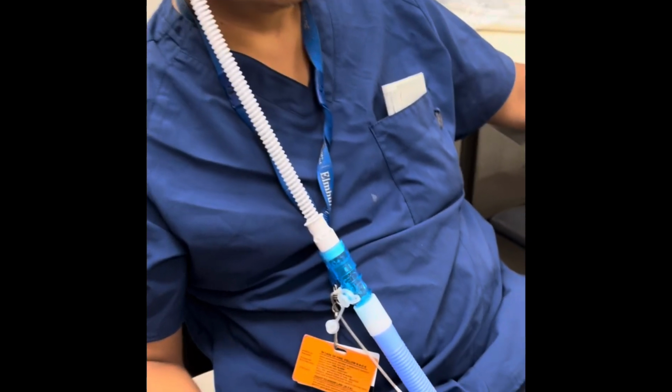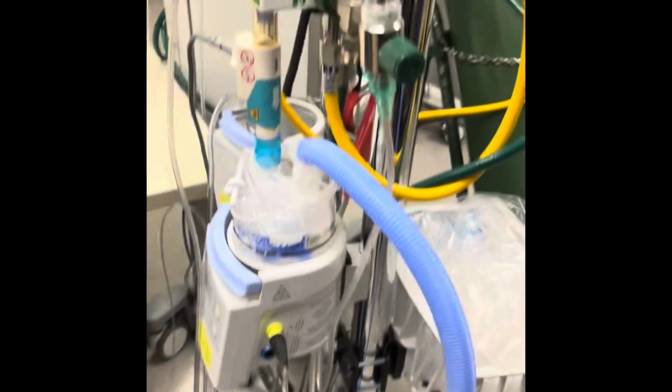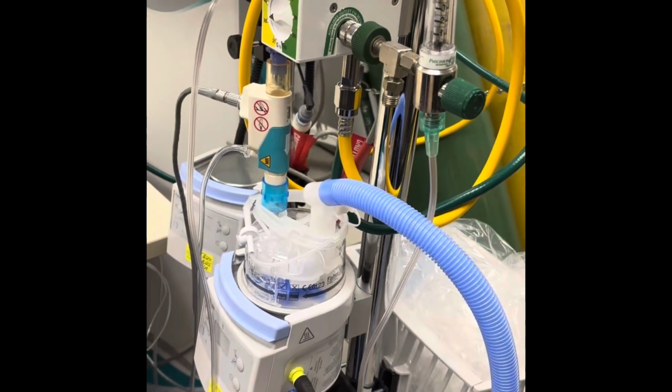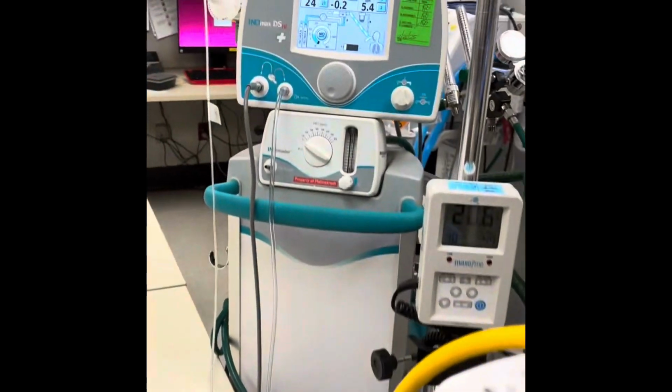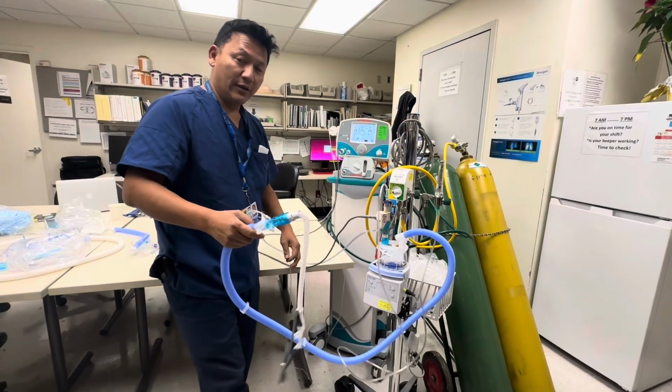But you need the blender though. But it's set at 2 right now. Yeah. If you don't set it at all, what happens? No, wait. You're gonna need something, right? You're gonna need that flow. You need the flow to deliver the medication, DJ. Yeah. You can't just not begin. We're gonna use this piggy.